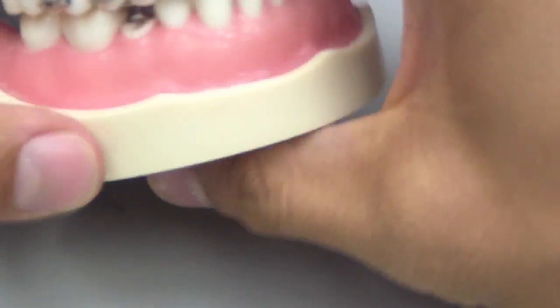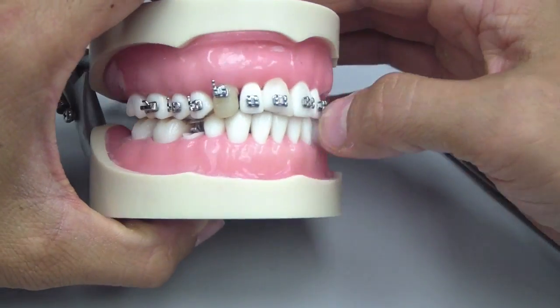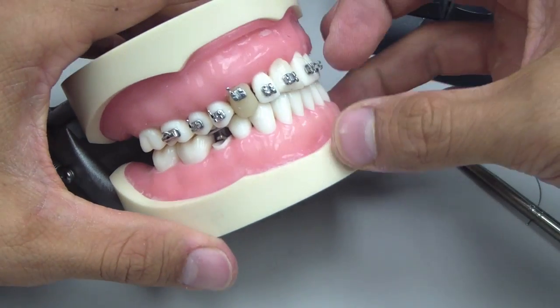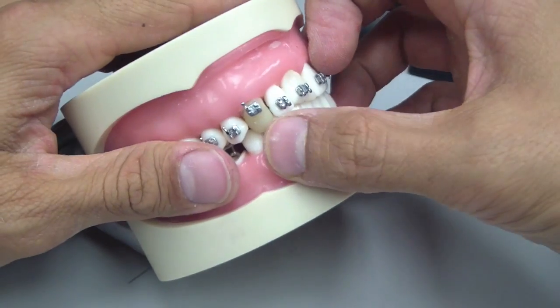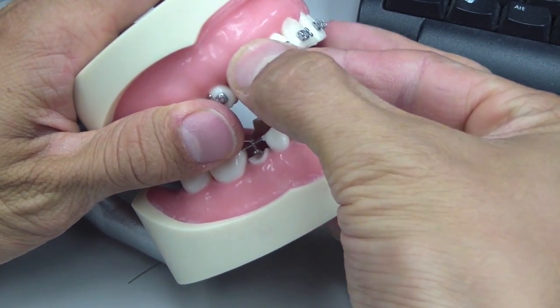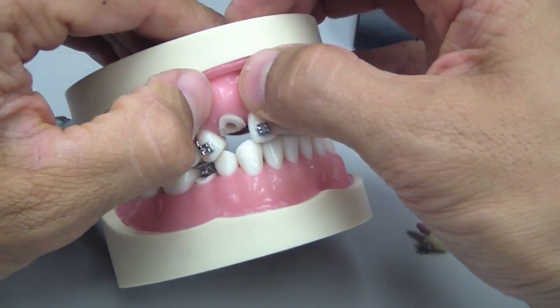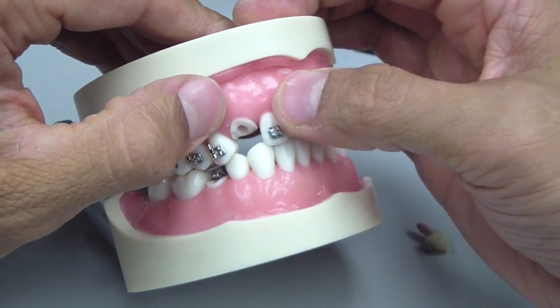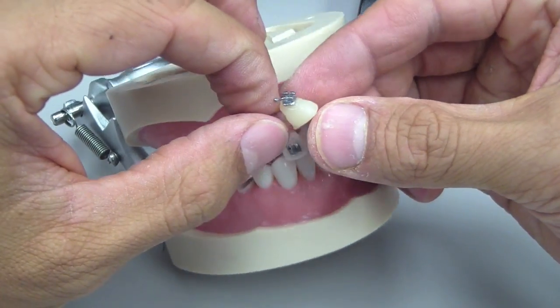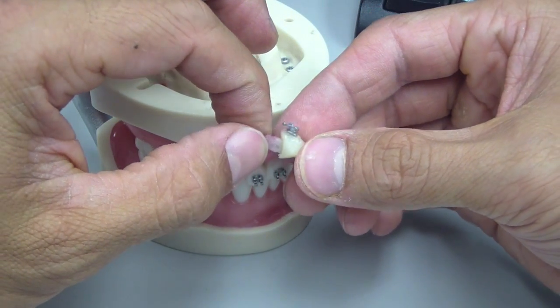So in this case we've got a fractured canine. We're going to show you briefly how I kind of rigged it for that case. Because we're all restorative folks, let me use the example of tooth number six, actually the right canine. What I did was just fabricate a simple bisacryl post-core crown — or you can use whatever material.